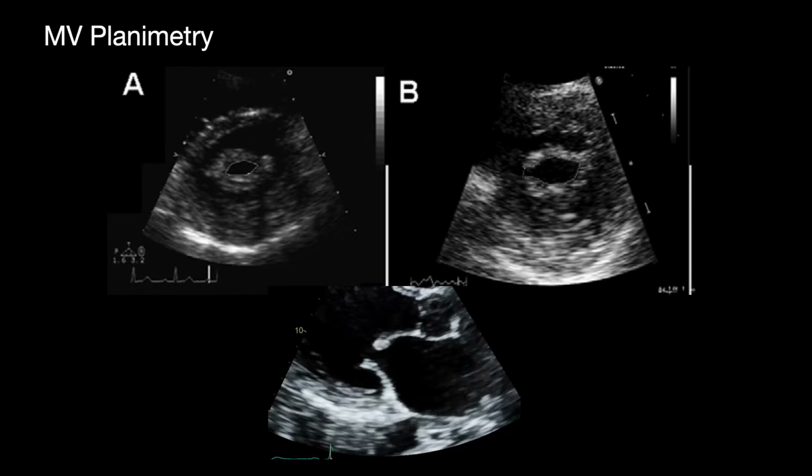You need a frozen image, and you also, again, need to pan through to find the narrowest aperture that you want to capture, because there's a difference in measuring the aperture right at the leaflet tips compared to further back where you may overestimate the mitral valve area. So the normal mitral valve area is 4 to 5 centimeters squared, but above 1.5 centimeters squared usually doesn't produce any symptoms at all.